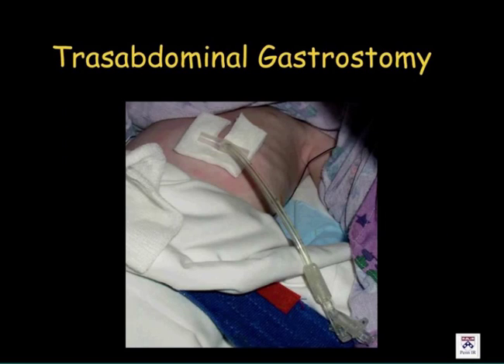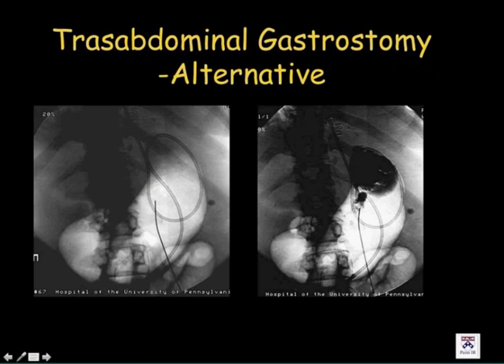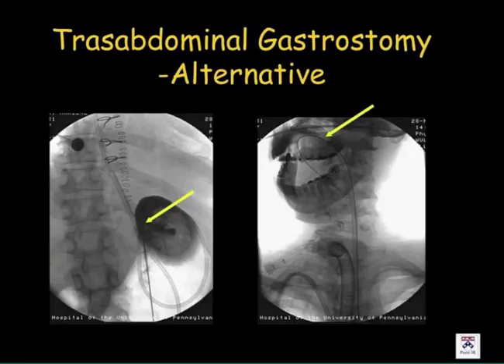In the adult population, we do it a little bit differently. We will bend an 18-gauge needle and point it in the direction of the gastroesophageal junction and try to feed the tube or wire through the gastroesophageal junction, and surprisingly it works all the time. I don't know how, but it works. Then somebody will feed the wire into the mouth. Somebody will grab the wire with a hemostat. You put your tube on the wire and slide it over the wire into the stomach.